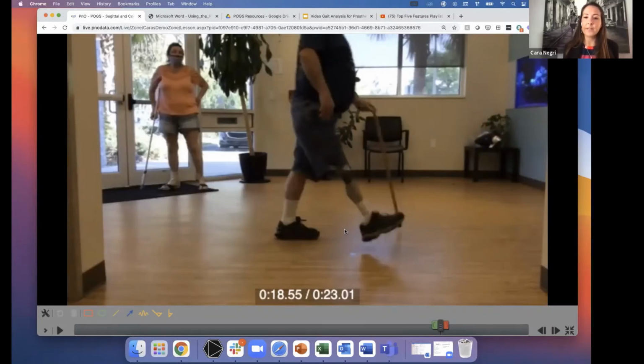He doesn't have confidence in this knee anymore. It hasn't been functioning very consistently for him. He's pretty rough on it. He says it's very intermittent when he feels the support, so that makes a lot of sense to me why he's kicking it so far out there. So I'll take a freeform angle again, kind of in line with his trunk here, and measure his thigh angle.